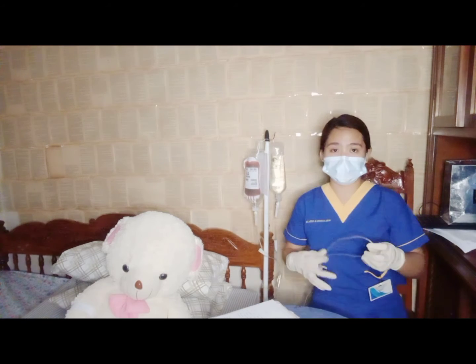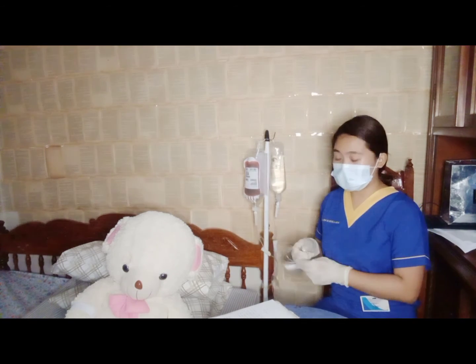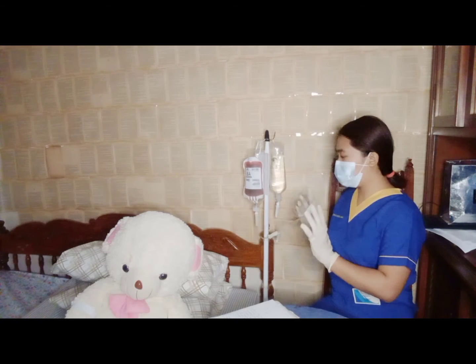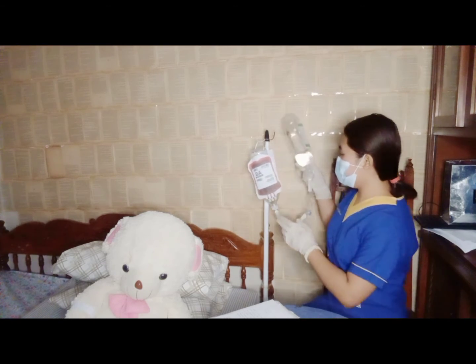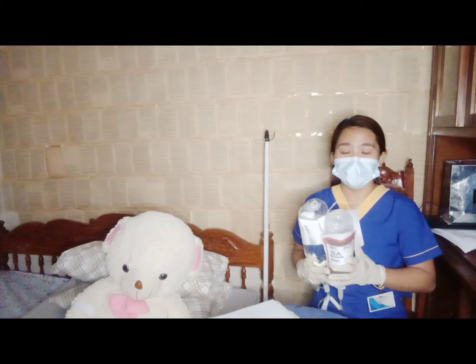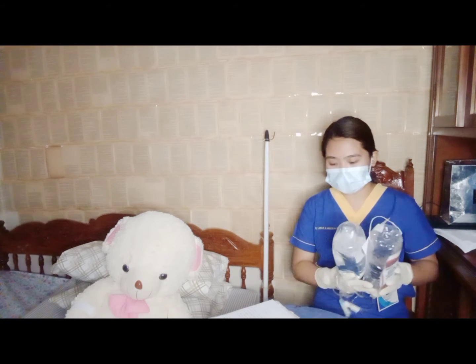And if the patient has an IV infusion or administration, kailangan nating ibalik yun. My patient has no IV infusion, hindi siya kailangang ilagyan pa ng IV infusion. So, we will dispose of the blood transfusion equipment sa proper disposal or kailangang ibalik sa blood bank based on the agency policy.